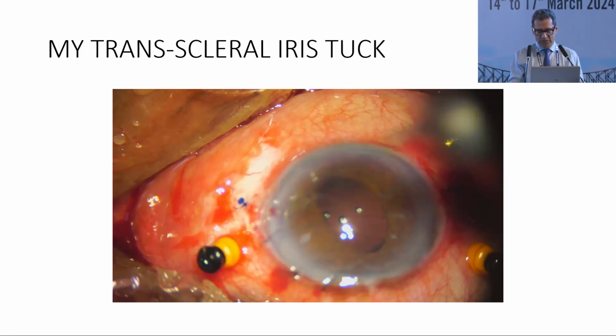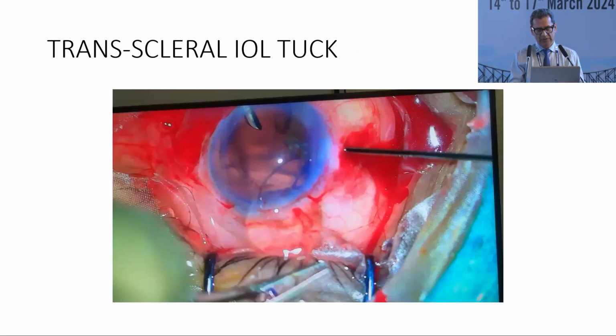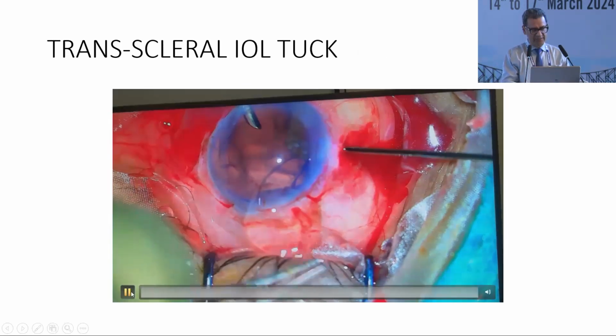And as you can see, my infusion is still there. It's the last which is coming out. So this was another brief procedure I'll show you all. Again, the same thing.